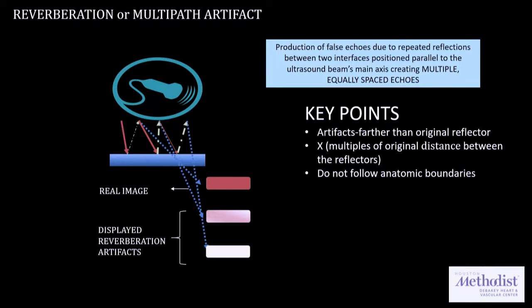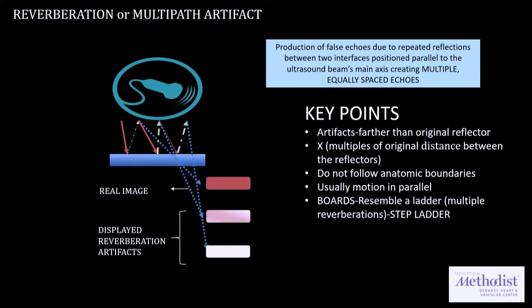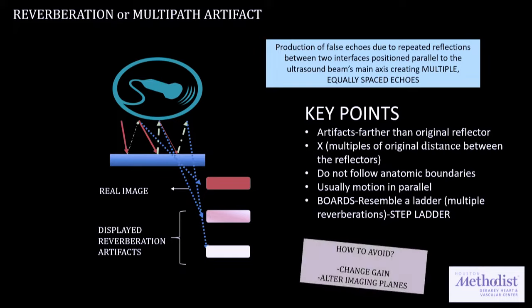Most of the time they follow beyond the anatomical boundaries, and they all move in parallel, right? Because they are related to the original reflector as well. And again, for boards, for the fellows, when you hear the term step ladder, that's again a term for reverberation artifact as well.